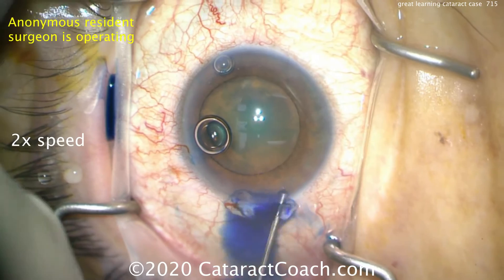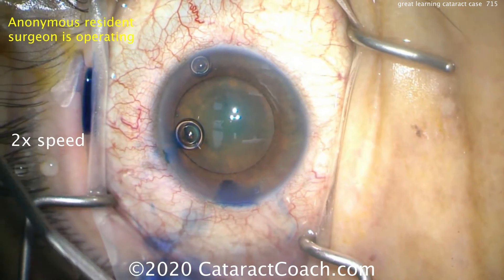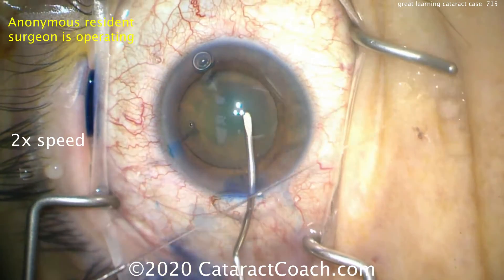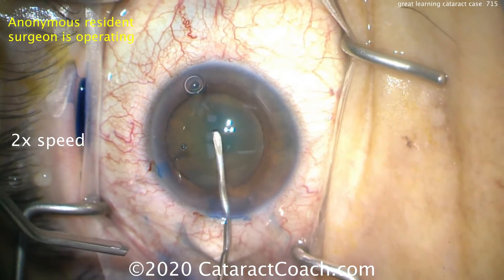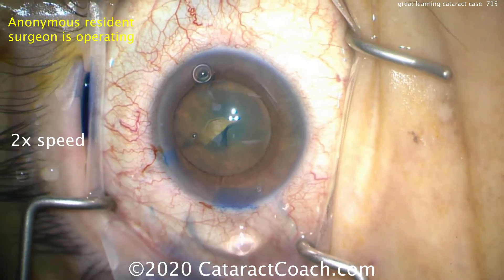Now time for the capsulorrhexis. A little more blue dye is being placed in the phacoincision and the side port because that will temporarily stain the corneal stroma. You can see the tunnel length, and that's very helpful. Here comes the capsulorrhexis, using a cystotome to begin with. Even though there's a reasonable red reflex, trypan blue dye is used — residents often do this because it makes it easier to visualize.